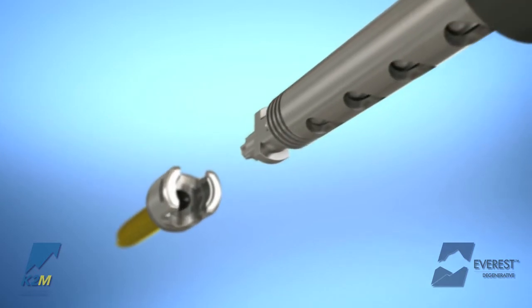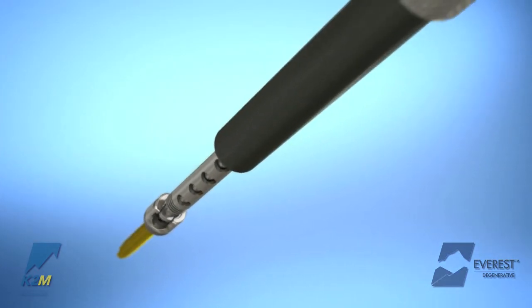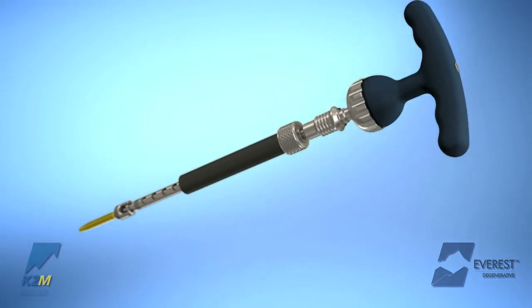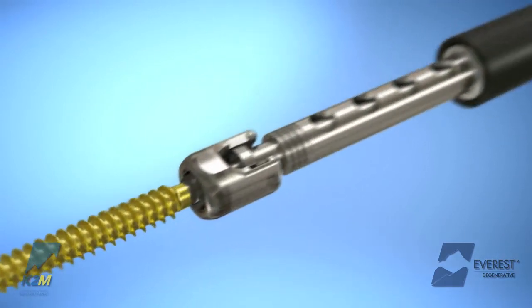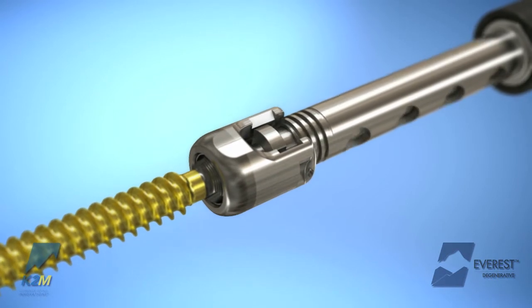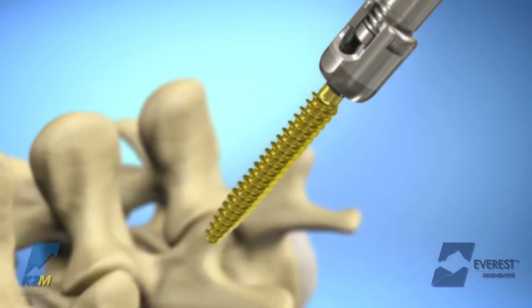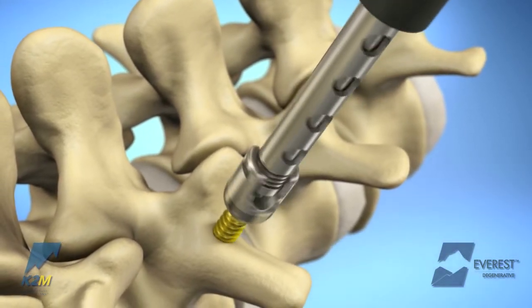After the proper screw length and diameter has been determined, the implant is loaded onto the distal end of the screw inserter. When using an Everest polyaxial screw inserter, grasp the implant by the shaft of the screw and apply a downward force to engage the screw into the hexalobe fitting of the screwdriver shaft. Thread the knurled wheel in a clockwise direction until the implant is securely attached to the inserter. The screw may now be inserted into the prepared pathway.